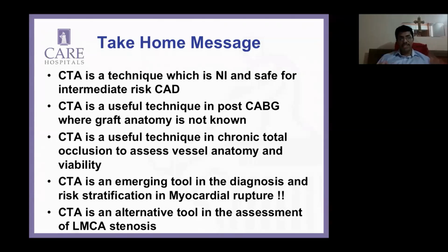But I've had a sizable number where a zero score did not equal complete safety. So in my lab, unless somebody is very particular and they've come in from the West and just want a calcium score and go away, I insist on all my patients getting the full scan. It takes another 5 seconds, nothing more, a little more radiation. So our calcium scores are done at about 0.5 millisieverts.